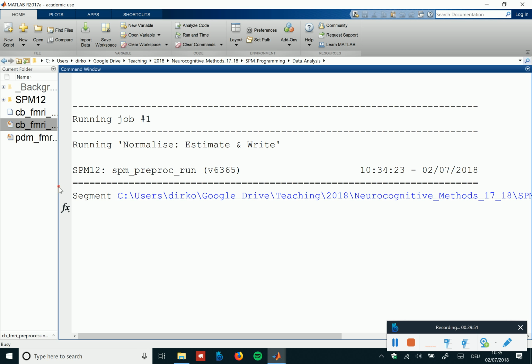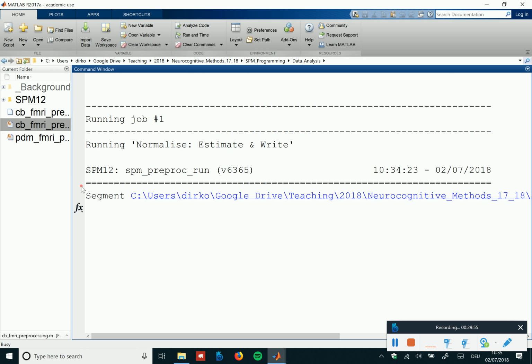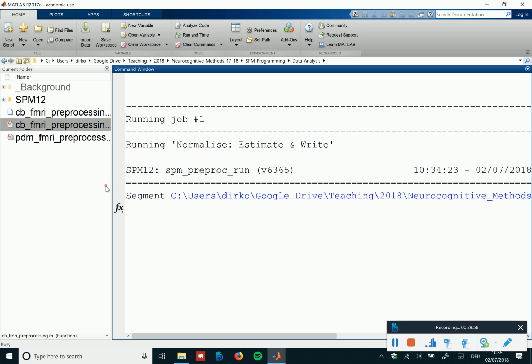Questions right now? Because right now we're waiting. So again, the details. There is a mathematical and statistical framework behind all of this pre-processing. As I said last time, we could have the same thing we have about random field theory-based p-values. We could have a similar course about this normalization here.